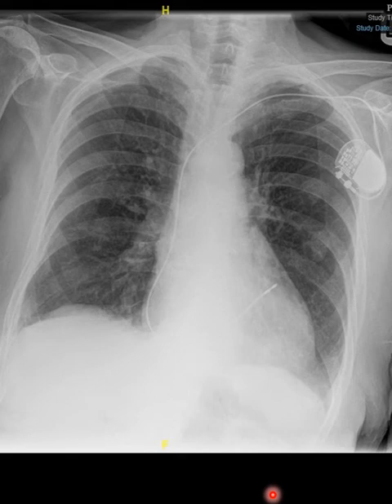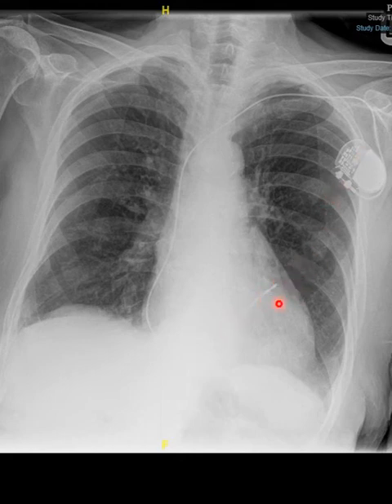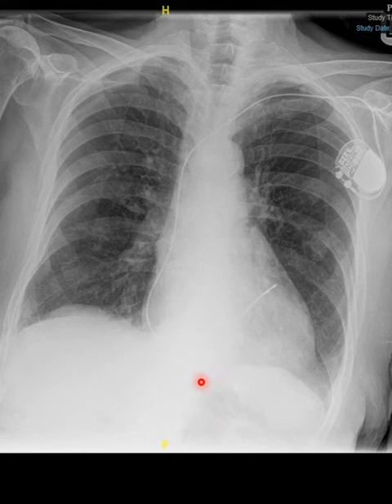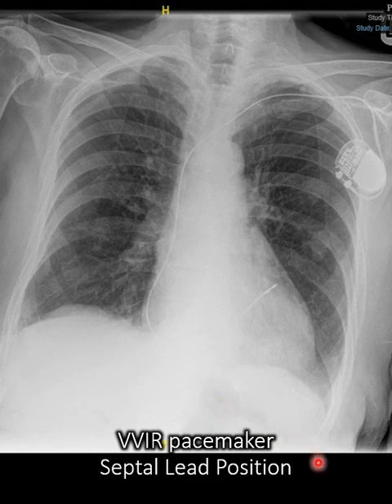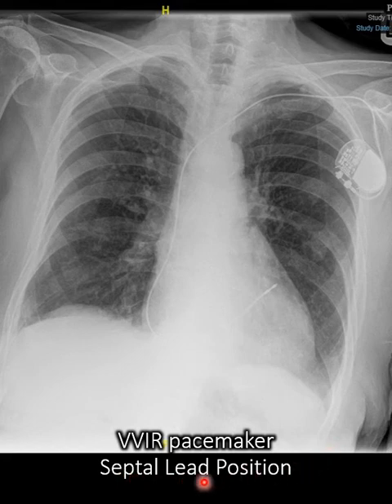We have one lead, there is no thick coil, so it's therefore a pacemaker lead. We wouldn't put an ICD lead in the septum because the shock would likely miss quite a lot of the left ventricle — it would always be in the RV apex. Look at the position of the lead at the time of implant. Most operators put an x-ray at the end so you can compare. This is a VVIR pacemaker — a single chamber ventricular pacemaker — and the lead is in the right ventricular septum.